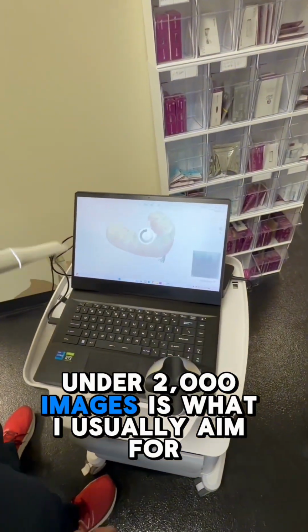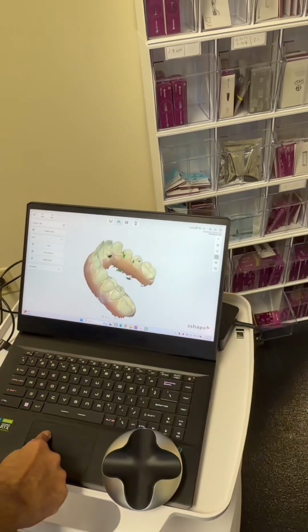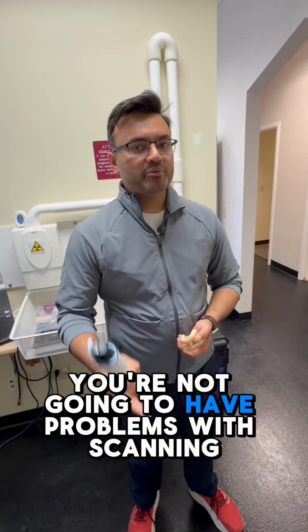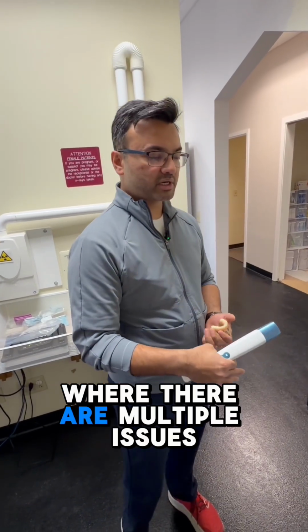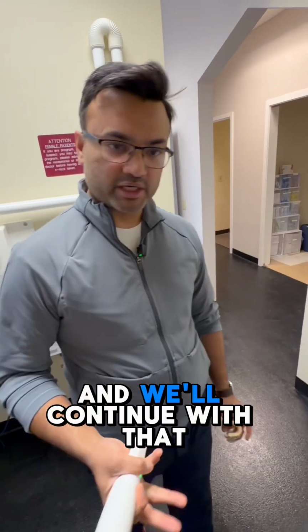Under 2000 images is what I usually aim for. Again, it's not really a hard number, but it's enough for me to know that it gives you a very consistent scan. Done. Post processing. If you understand this concept clearly, you're not going to have problems with scanning. We'll do a series of videos on the multiple issues that I often see when people are scanning without even realizing that these are problems they are making. And we'll continue with that.